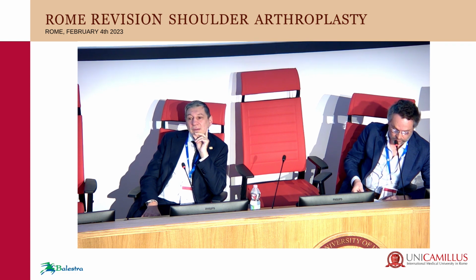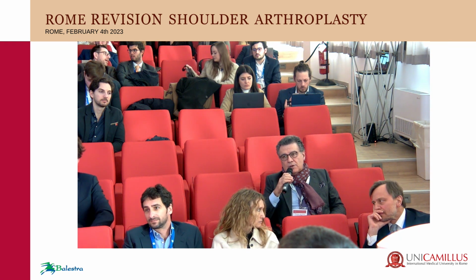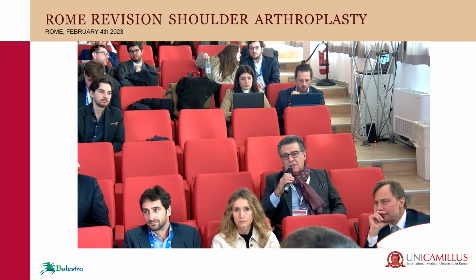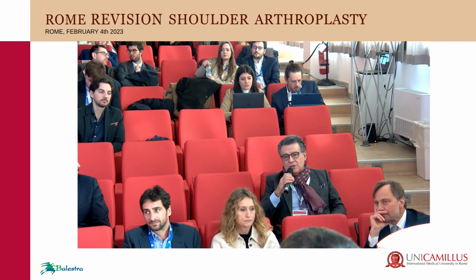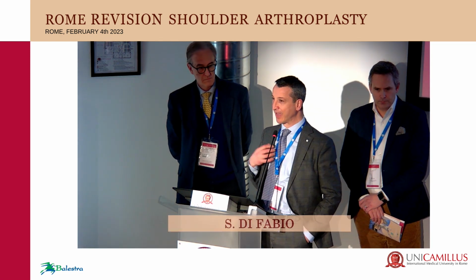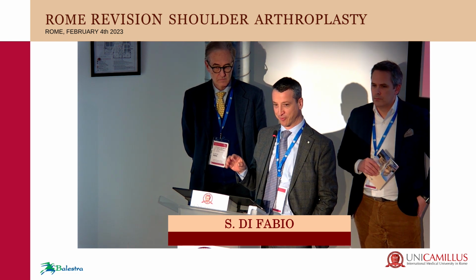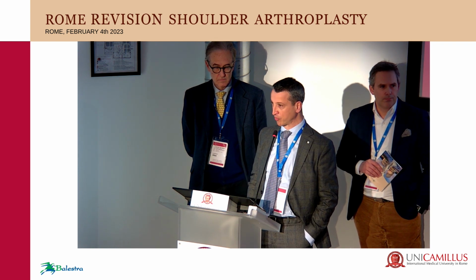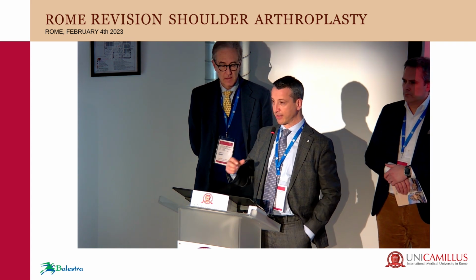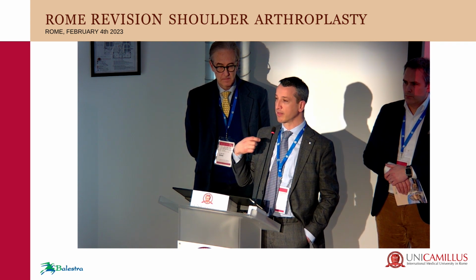It's for Fabio. Fabio, do you think that modifying the orientation of the glenoid or doing a posterior capsuloplasty makes sure that anatomical shoulders can be stable? I don't. I just read the case report, but I have never done a capsule plication for posterior instability during anatomic shoulder replacement. What happens, in my experience, is when you put all the components in, I try to do what Giovanni said this morning, the trial to test the stability.